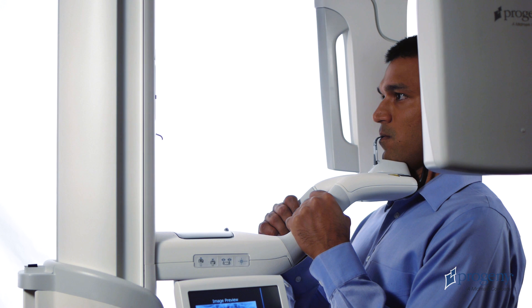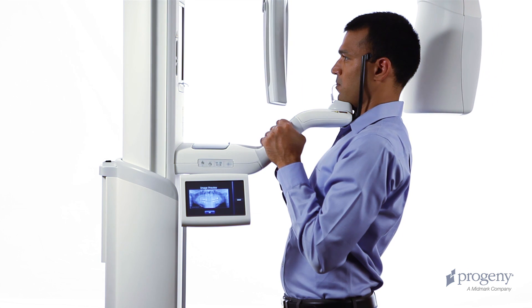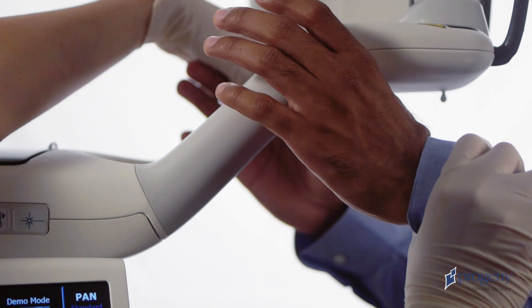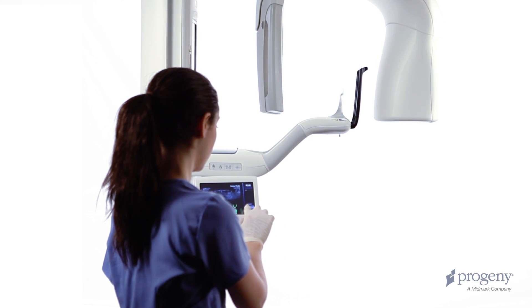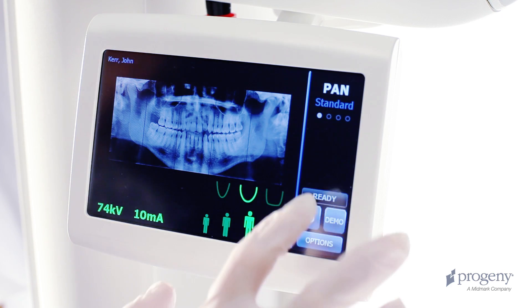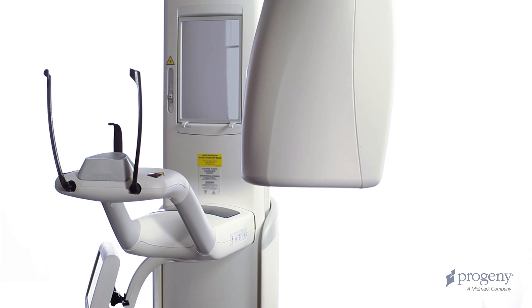Perform the examination. At the end of the exam, the overhead structure drives to the patient exit position. Advise the patient to remain in place until the overhead comes to a complete stop. At the end of the return movement, the head positioning wands will open. Assist the patient in stepping back and out of the structure. Tap OK to accept the image. At the end of an examination, the overhead structure is in the patient exit position — the gray ready indicator verifies this. Press the cycle button on the Vantage Touch once to bring the overhead structure to the patient entry position.